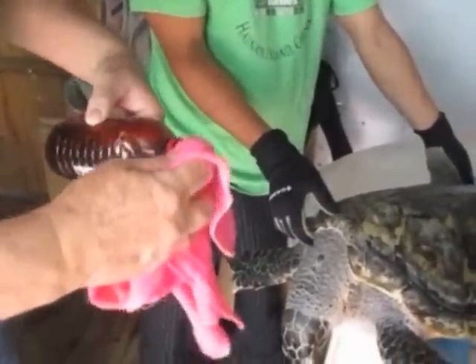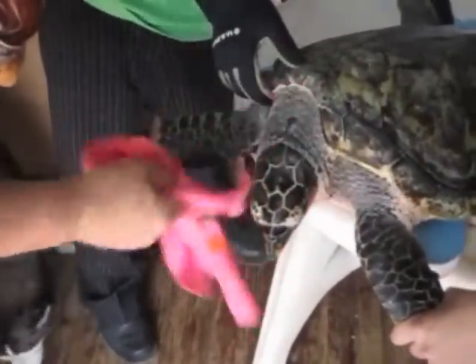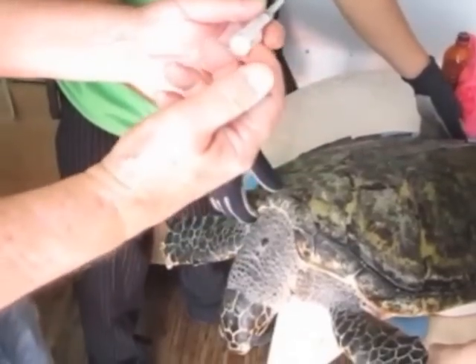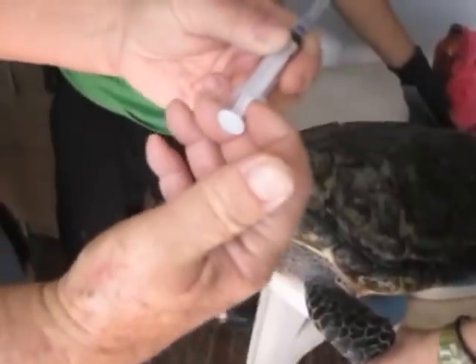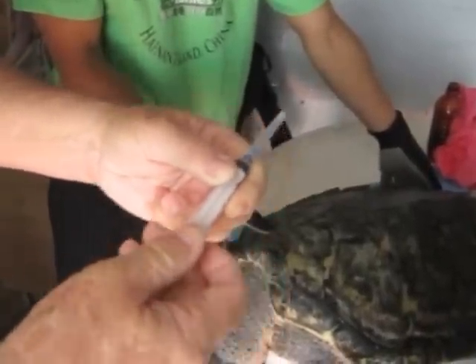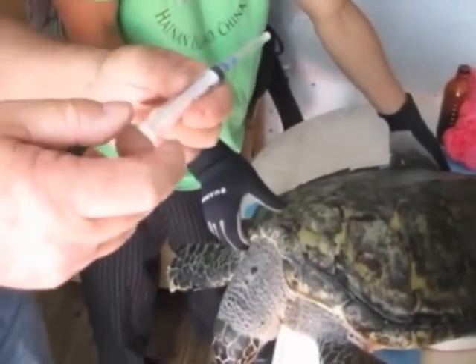Turtle's being good. Kind of make a clean area for the place where the needle's going to go in. This turtle's neck is already pretty darn clean. Everybody's got a little different technique on how to hold this. The way I do it is index finger and middle finger — the back of my fingernail on the index. This is the holding place, and then my thumb comes over as the pulling place.